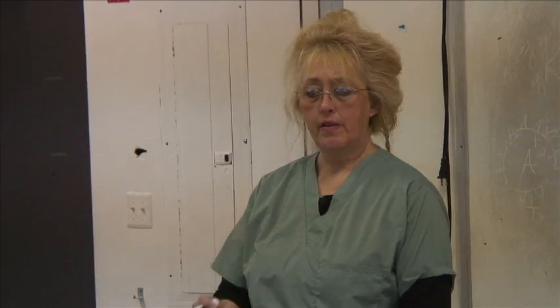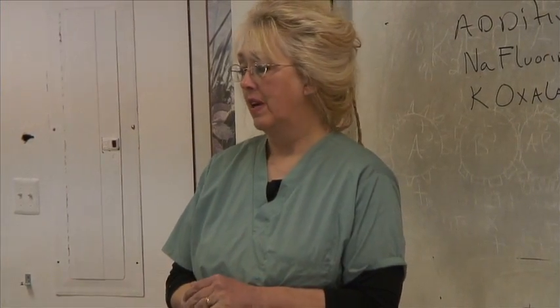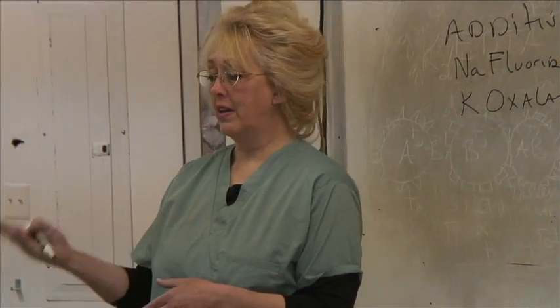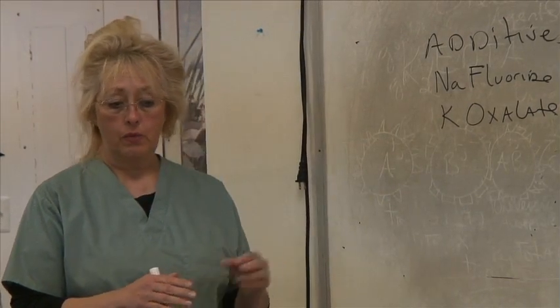So some people teach tubes according to preservative, which you should know, obviously. I think it's important to be aware of the colors as well. Okay, colors of tubes will help you. You saw with the serum separator tubes yesterday, they can have silicon gel in them, or they can be sans silicon gel. Plasma separator tubes are your stat greens, which can contain lithium heparin and or sodium heparin. And that's pretty much the tubes.